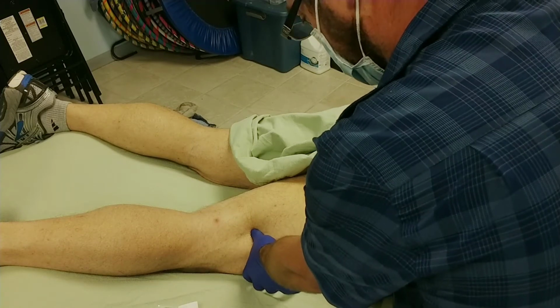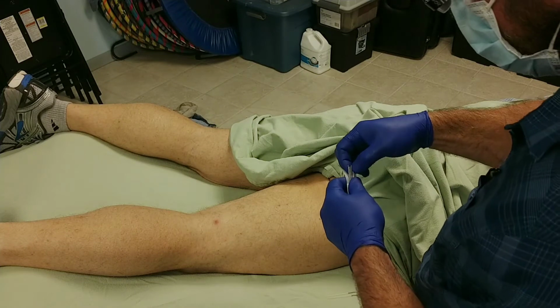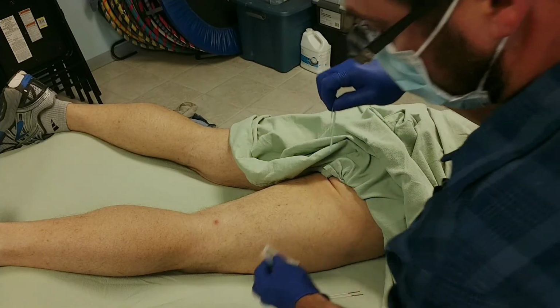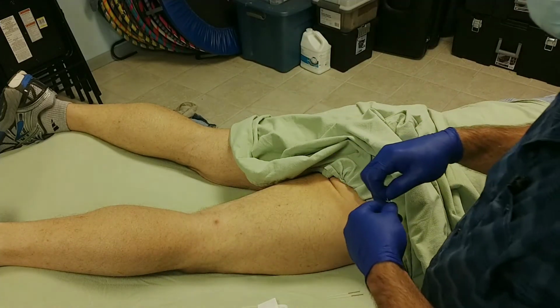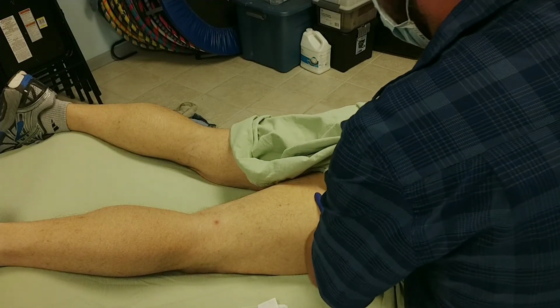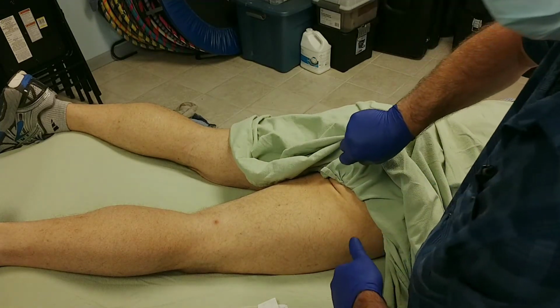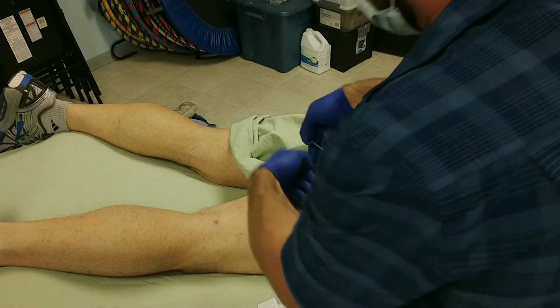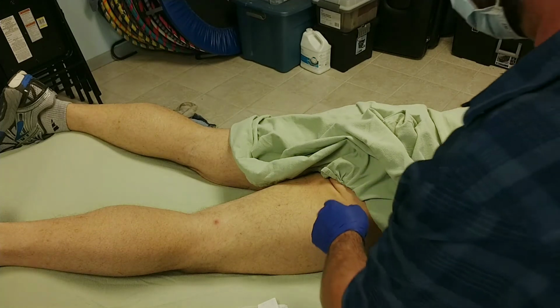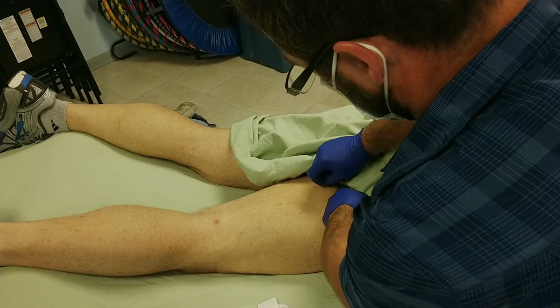That's biceps femoris' short head. You can needle all of them at their combined tendon at the top. Likewise, you can needle the insertion at the head of the fibula. When I'm needling the superior aspect, it really doesn't matter the direction, but I tend to needle from lateral to medial because I feel less like I'm sticking my hands in their butt trying to get medial. Though sometimes I will do it straight in.